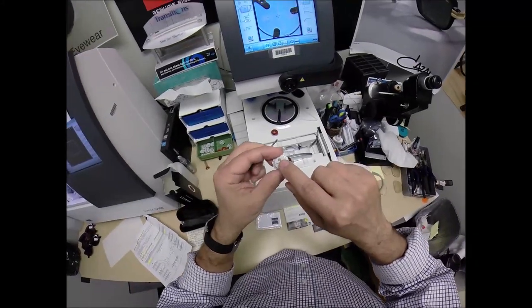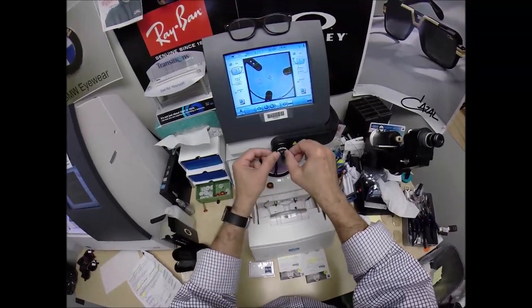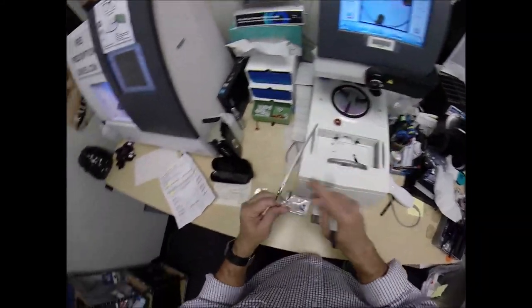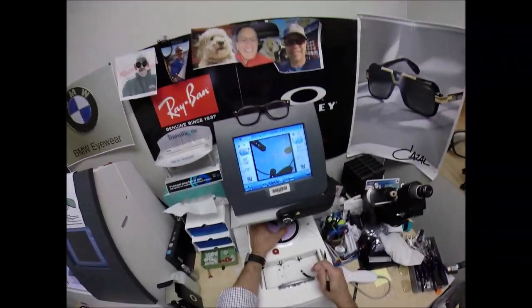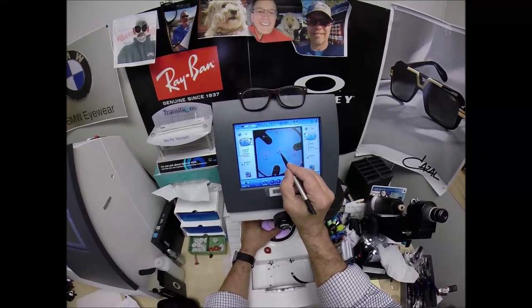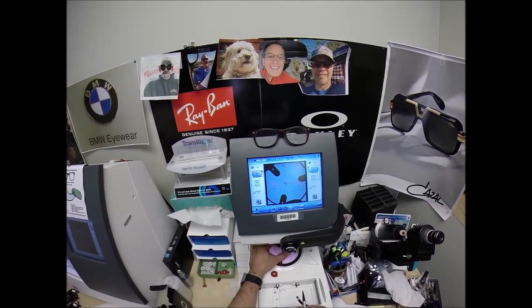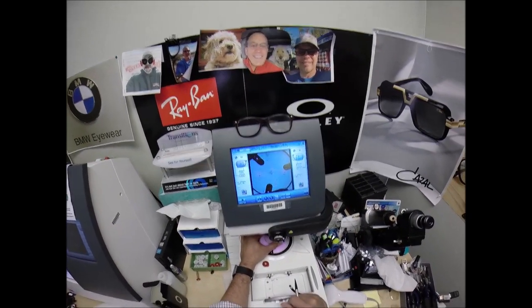That silver button on the back is a magnet. It's going to do its job twice. The first time, it's going to attach itself to another magnet there in the arm. Let's go ahead and take the frame out of there. Get everything laid out. The blue cross is the geometric center of your frame. Your eye is just above that and barely inset. Get everything laid out here.